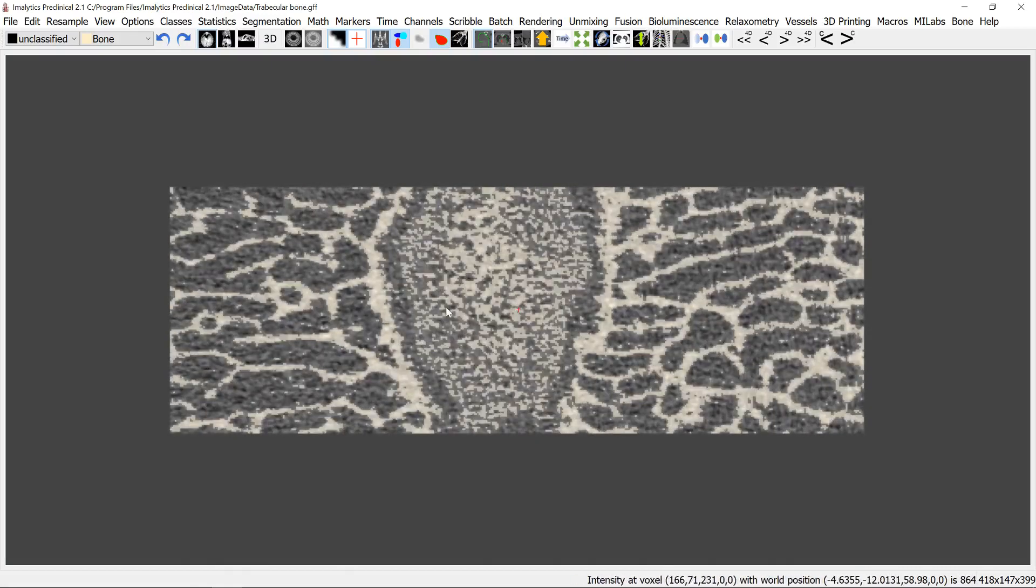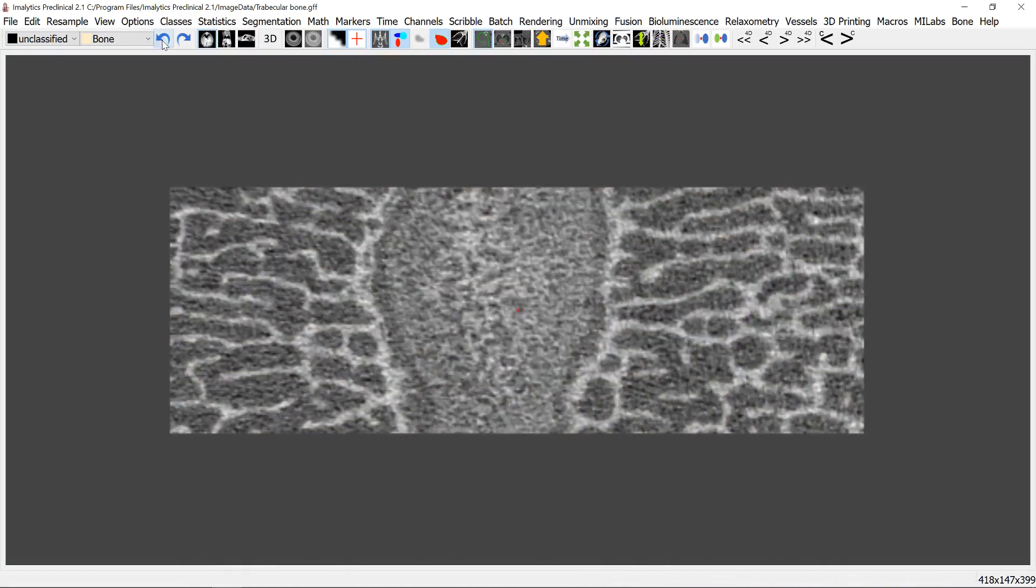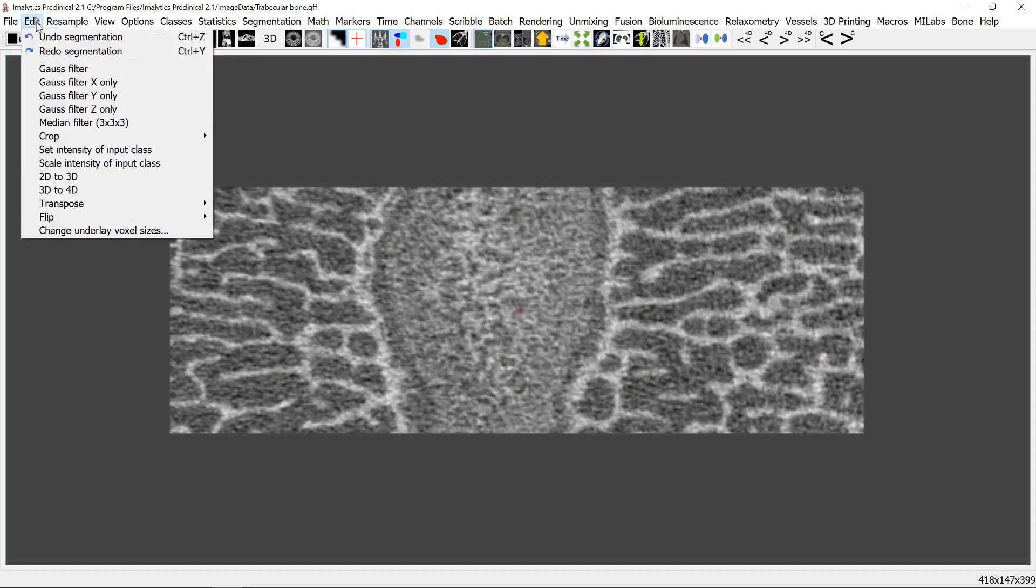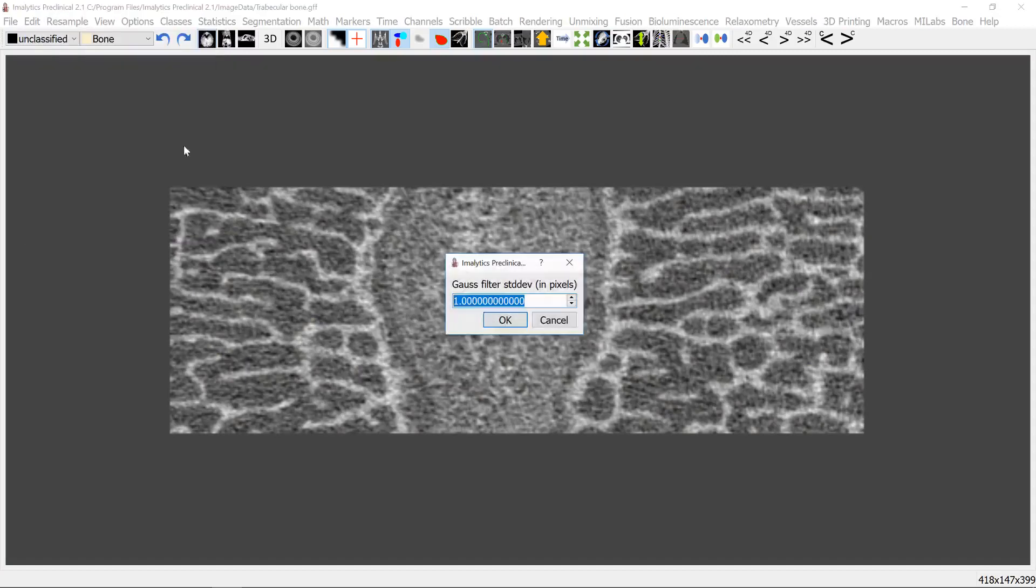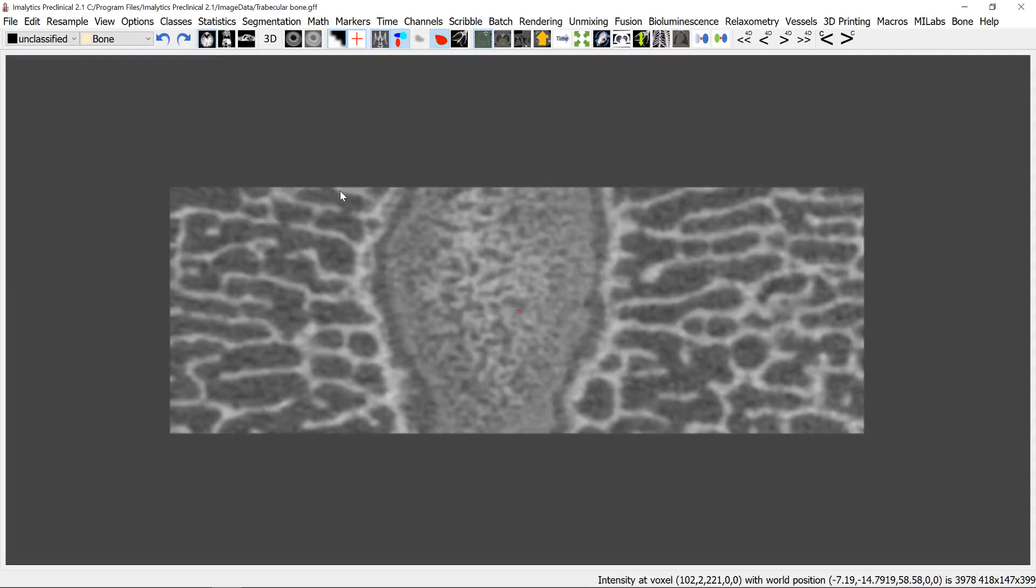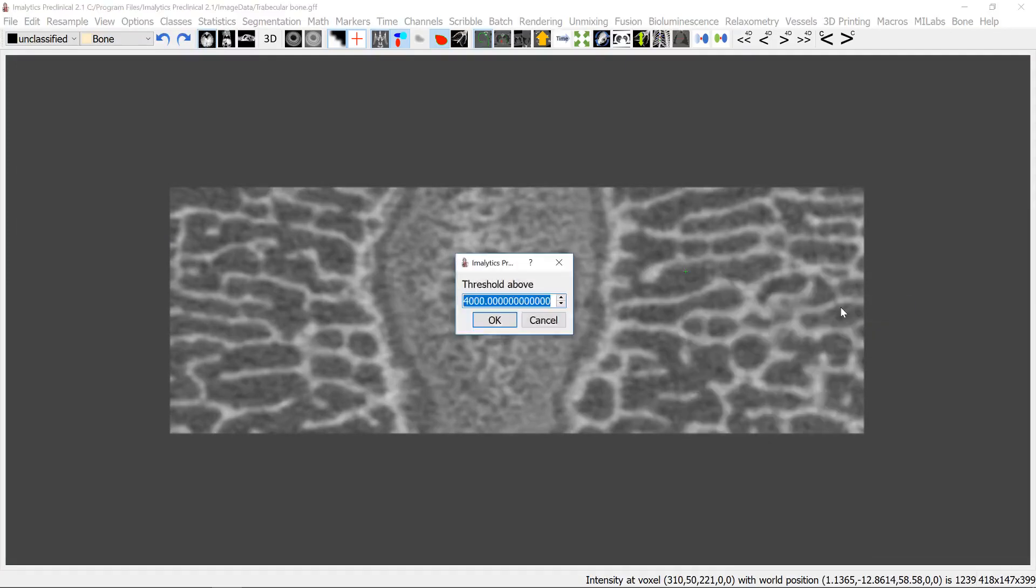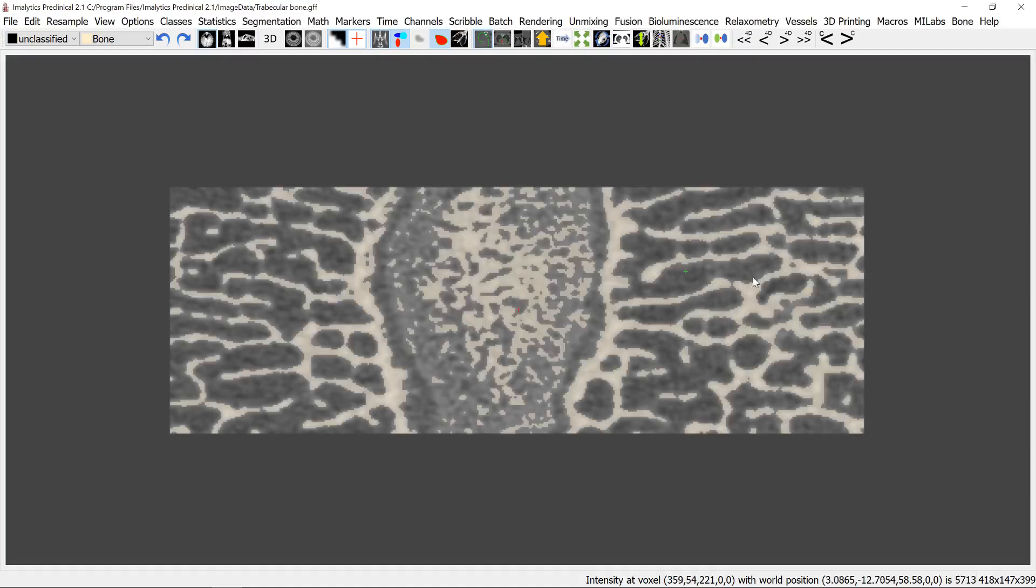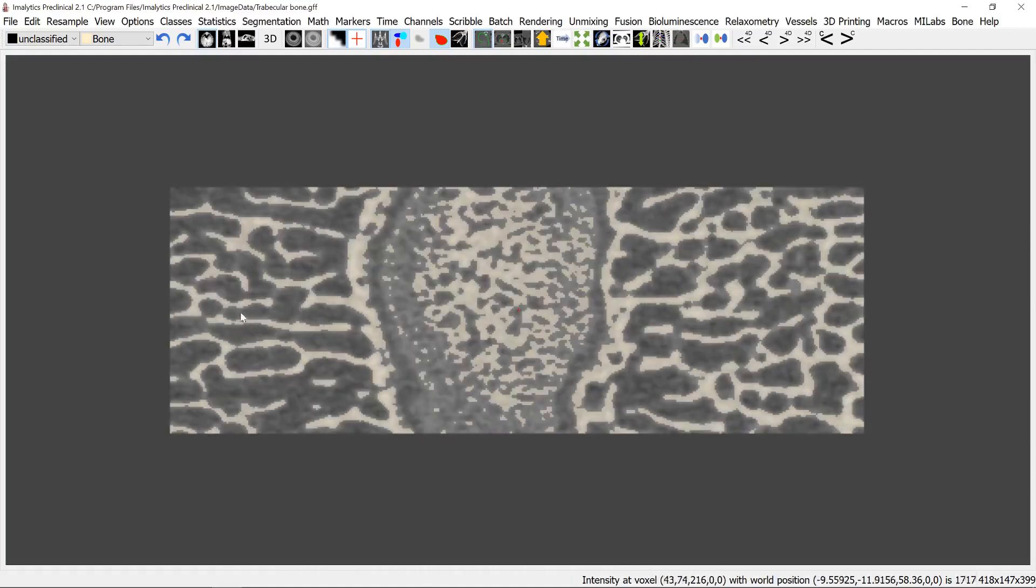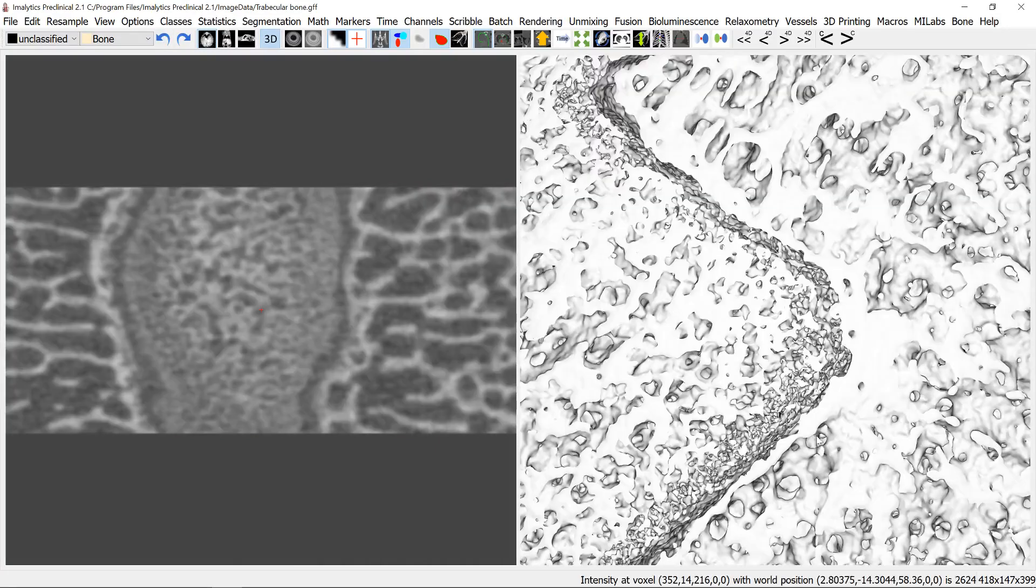So let's undo this and apply a Gaussian filter with one for example and now can perform the thresholding again and now it looks better. So now we don't have these small spots everywhere.